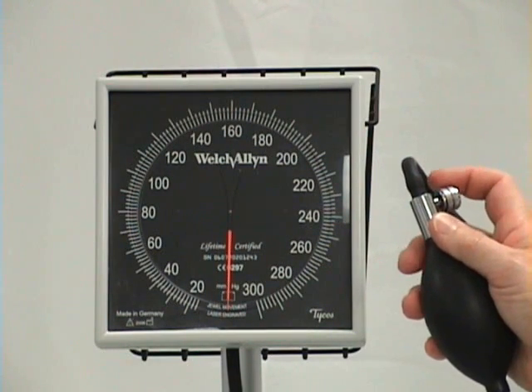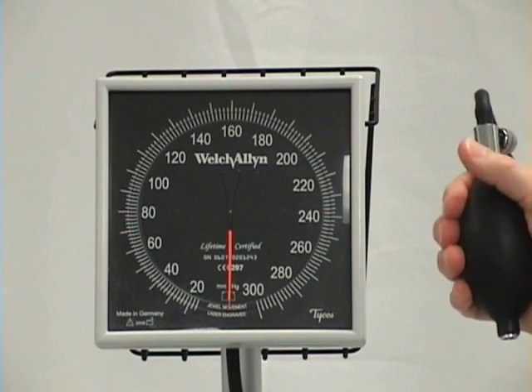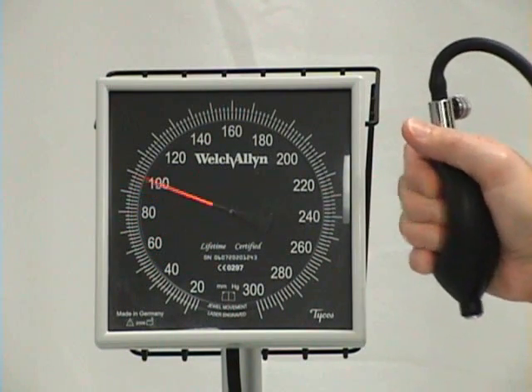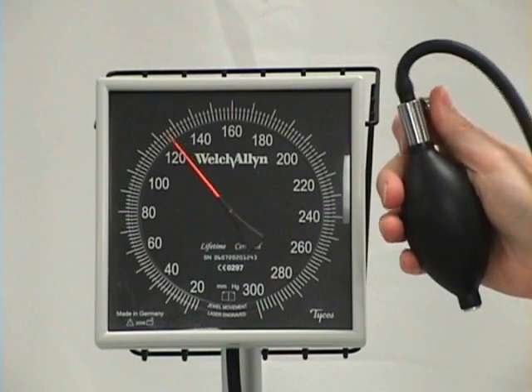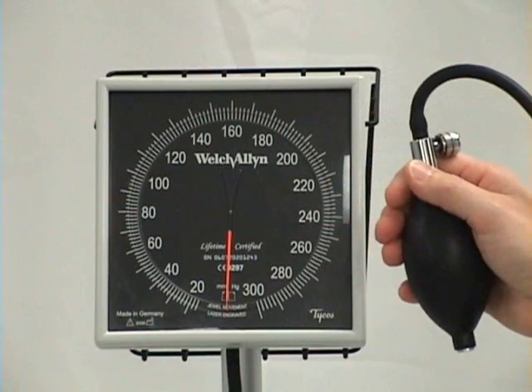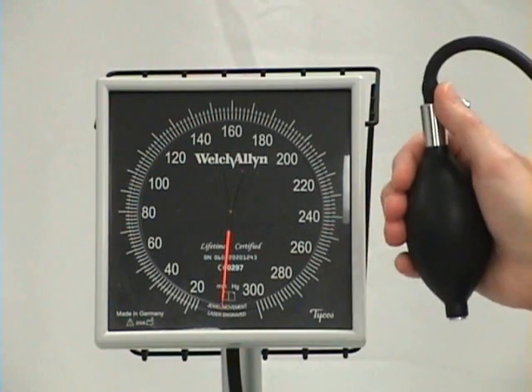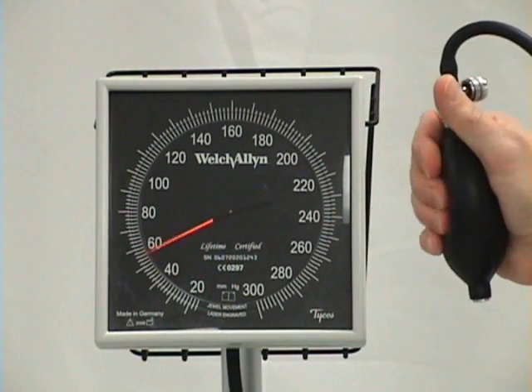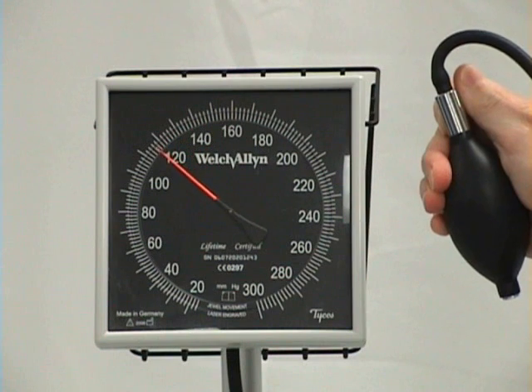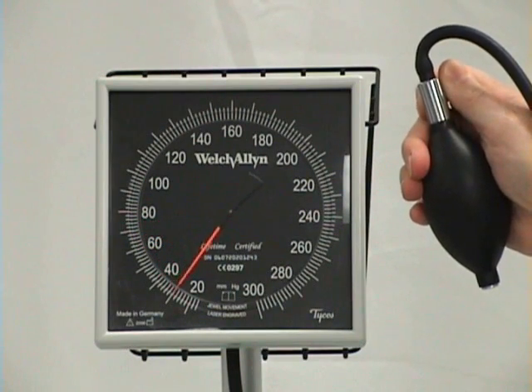When you're ready to obliterate the pulse, make sure the valve is tightened but only so much that you can still loosen it with one hand. Squeeze very quickly and very gently until you've lost the pulse — I lost it at 120, so I'll let that out quickly. Now I'll take my patient's blood pressure: I know I lost it at 120, so I'm going to pump it up to 150, making sure the valve is secure but not too tight. Squeeze hard to get up to 150 quickly, then let it out very slowly.